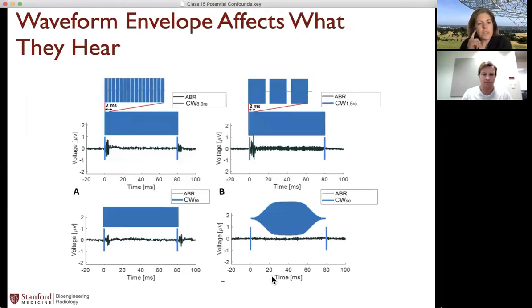Okay, so we went one step further in order to look at, well, what is it about the waveforms? So we looked at 4 different waveforms here, and most of our experiments had been a continuous wave with a rectangular envelope. That meant that it was just on for 80 milliseconds straight, and the envelope was rectangular, so it went sort of instantaneously on and then instantaneously off. And what we see is that there was a response right after the on, and you can see that this is the ABR here, and then also with the off, there's an ABR.